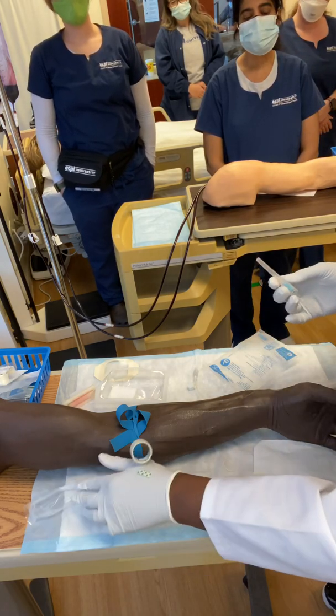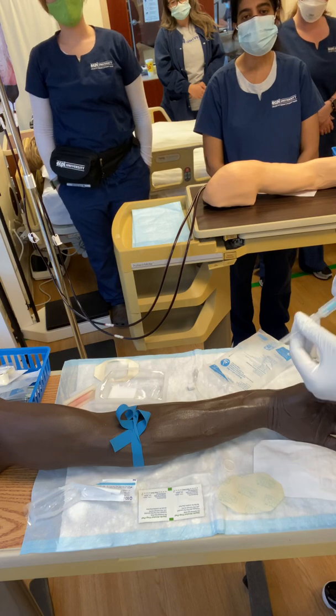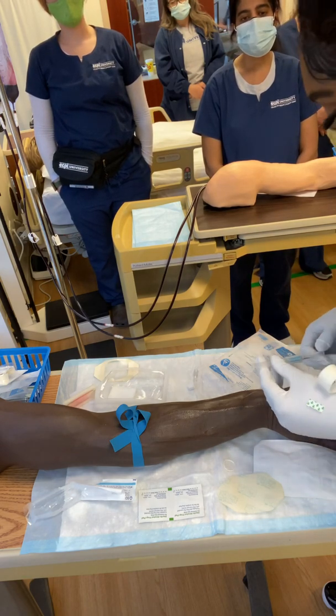We have our vein nice and bounding and ready for us. Oh, this is a different one. Interesting. Okay, I'll roll with it.